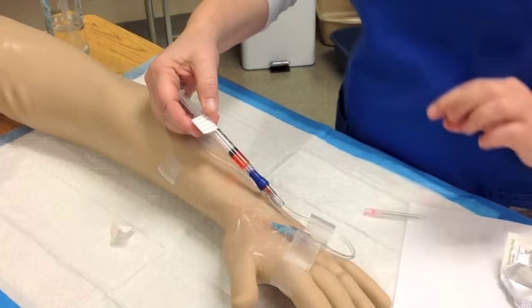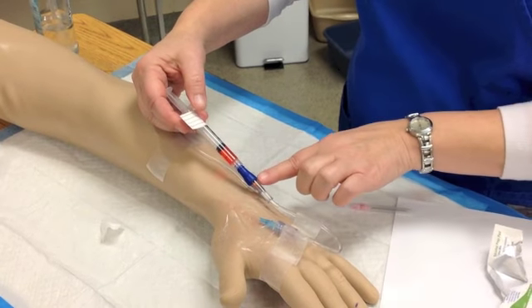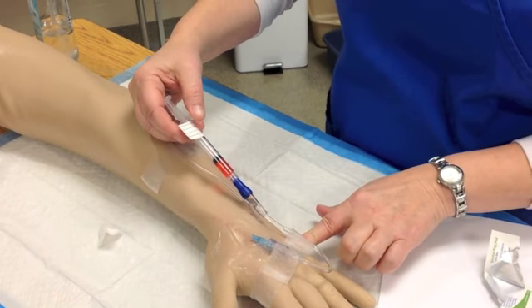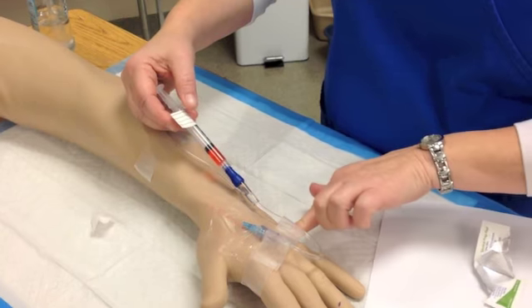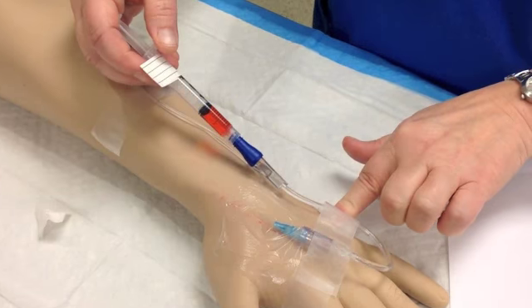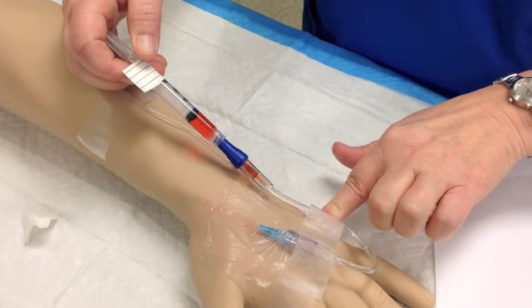And you notice it goes in there. So if you'll notice my IV's running, notice how clear that's getting. It's going to push the medication through. Okay, so I'm going to look at my watch. I'm going to wait about 12 seconds. I'm going to push 0.1 again.